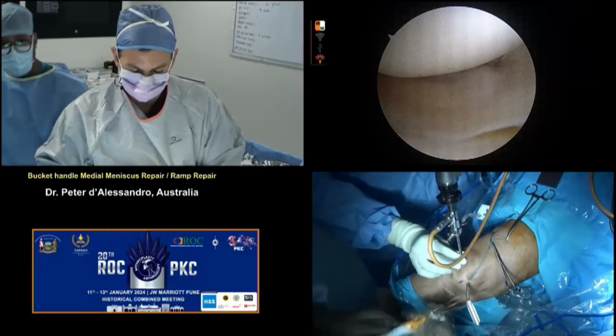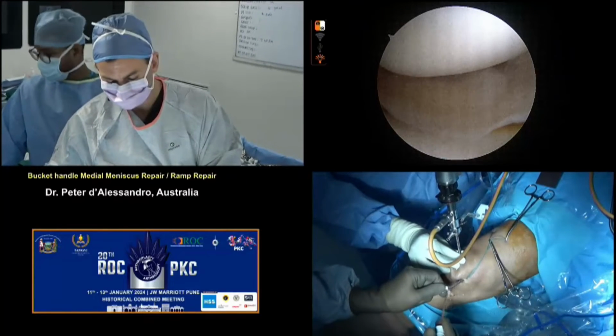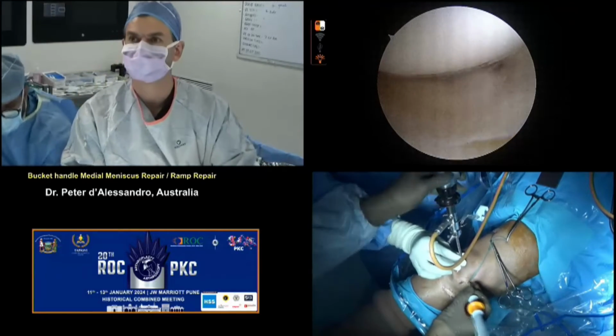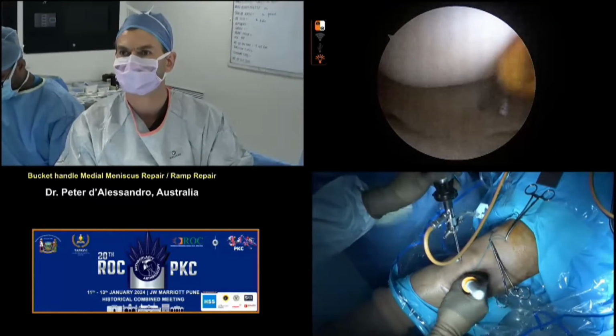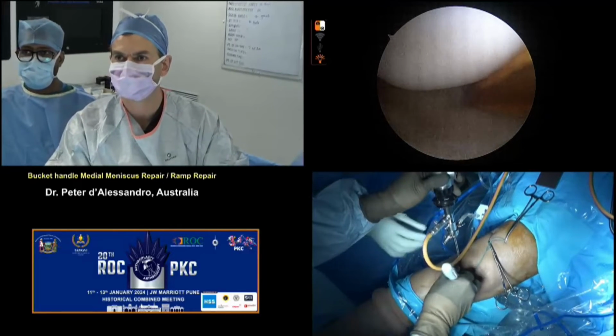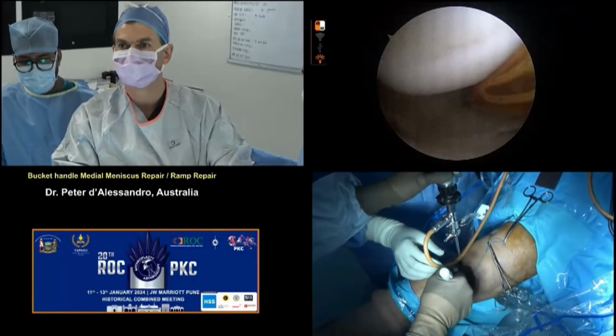So Peter, I'm going to back you up a second in terms of actual landmarks and how to do your pie crusting of your MCL. Could you explain kind of where you're going, what you're feeling? Yeah, great question. So, yeah, hold the camera there.